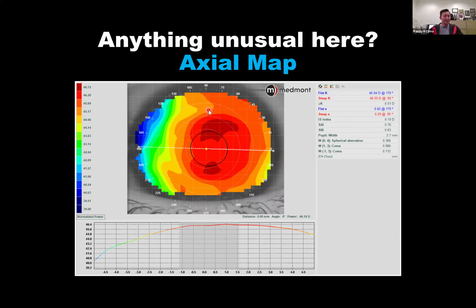So while the axial is good for understanding vision, if we want to understand molding in the eye surface or any acute changes in the curvature, we really want to switch to another analysis. Y entonces, como nos comenta Randy, si queremos verificar el poder que puede tener esa córnea para entender agudeza visual, podemos usar un mapa axial, pero si queremos verificar cambios minúsculos o cambios irregulares, quizás tenemos que cambiar de mapa para poder notar la diferencia.